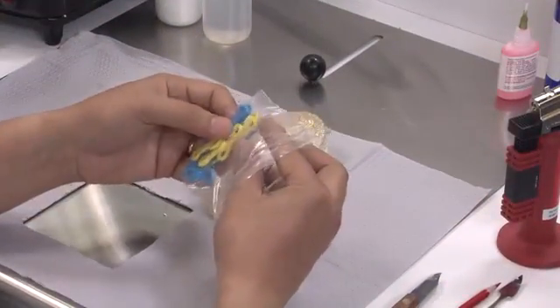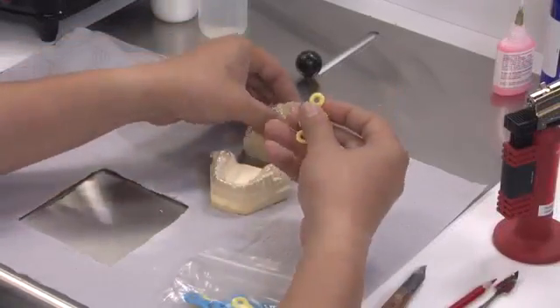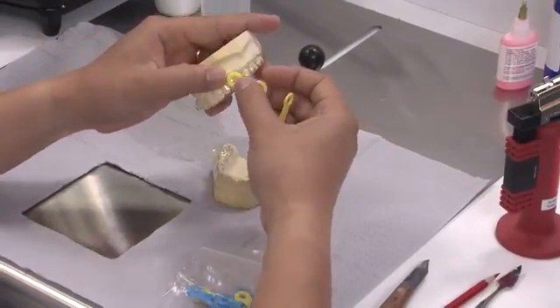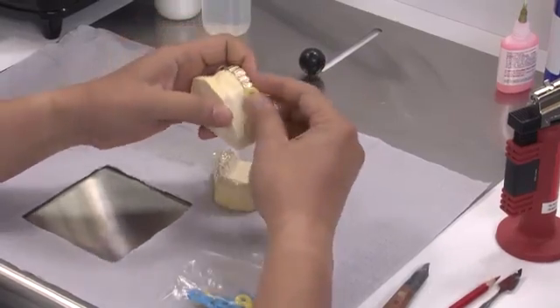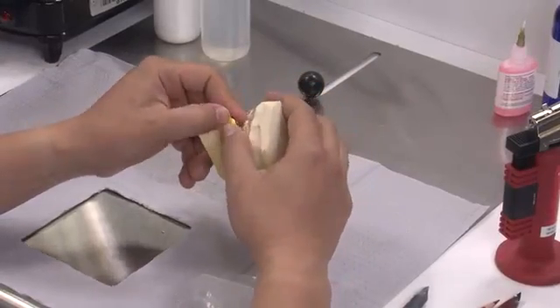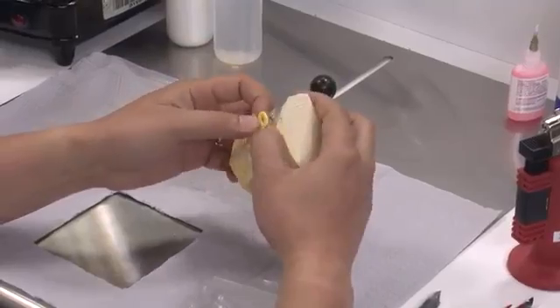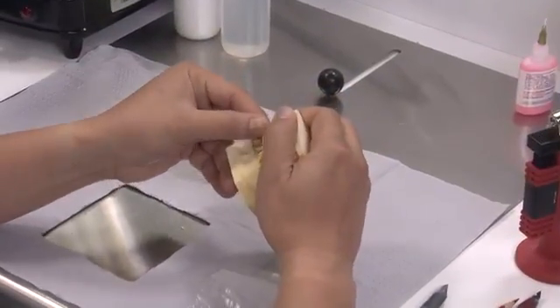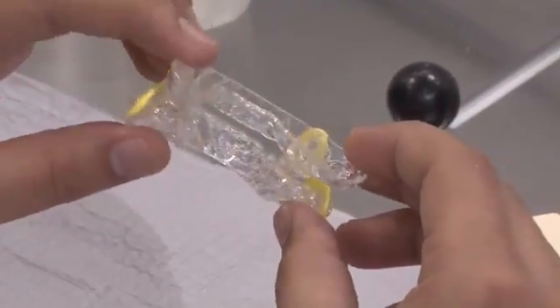Remove a set of yellow 21mm EMA straps from the strap kit. Slip the straps over the hooks on the upper tray. Then over the hooks of the lower tray. Perform a final QC of the appliance before delivery.